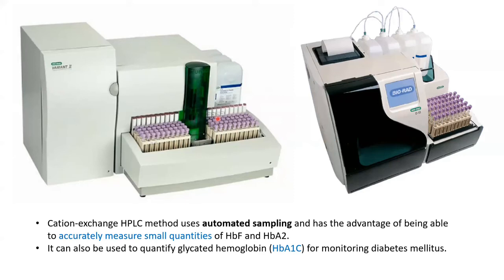Apart from BioRad, you have machines from Tosoh, Menarini, and Primus, which also give similar results. It's just that the resolution of the peaks and other things are different. We'll come to that later in the subsequent slides.